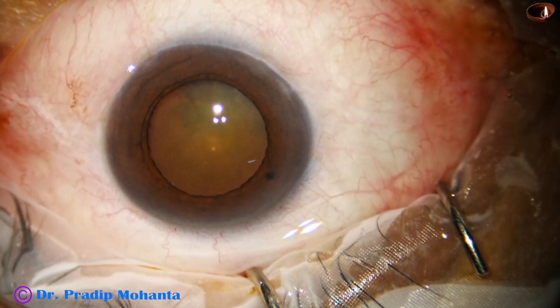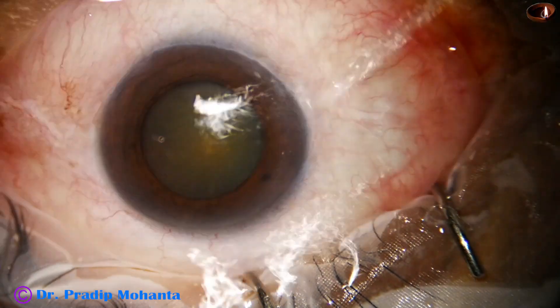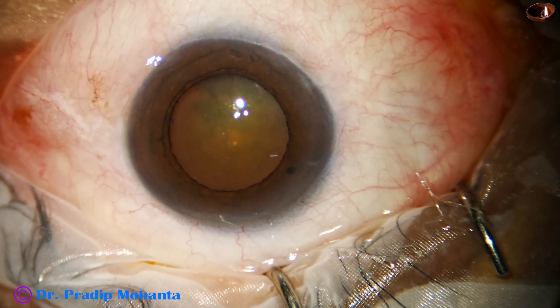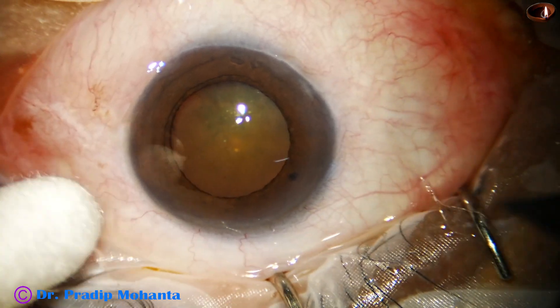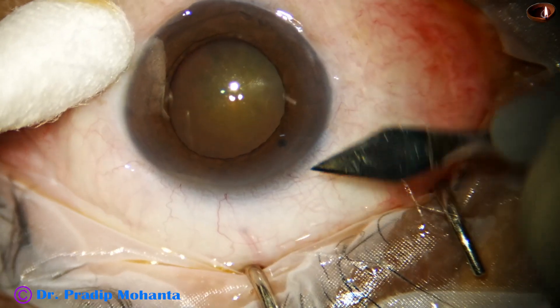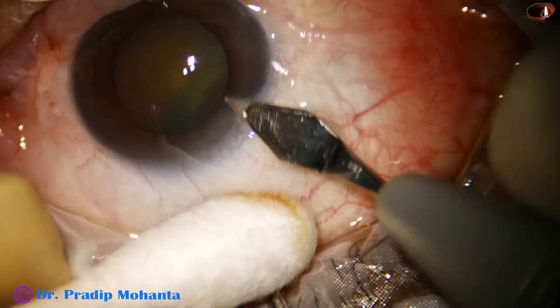The ocular surface is thoroughly irrigated after applying a few drops of povidone iodine, and now the main incision is being made with a 2.8 millimetre steel keratome at around 11 o'clock.